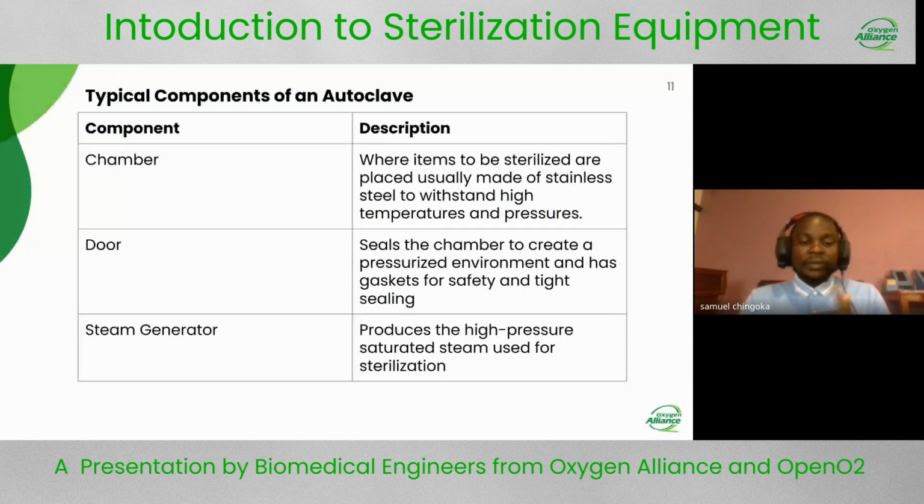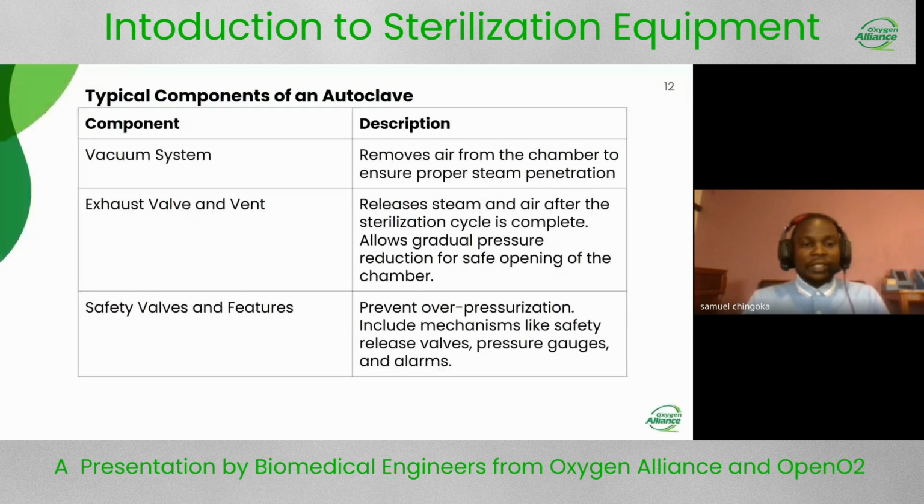We also have a steam generator, as we have said that steam sterilizers, these autoclaves, use steam. We have a steam generator where we boil water to make it into steam so that we introduce it into our sterilizing chamber for the process.